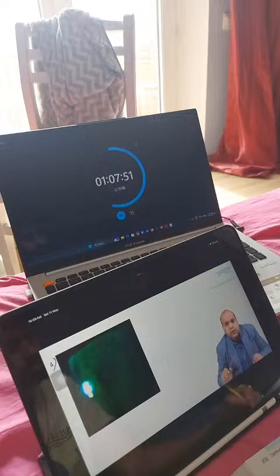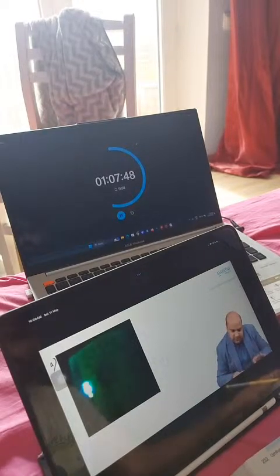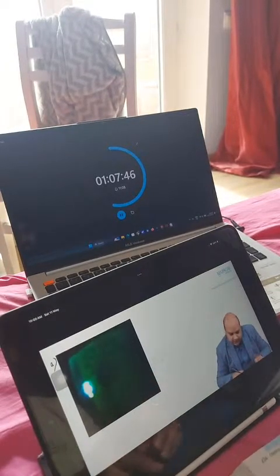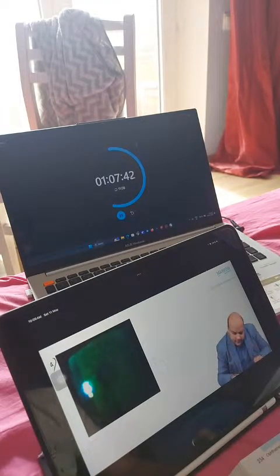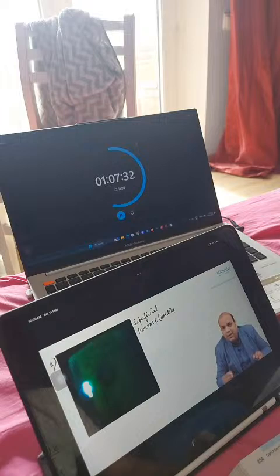A. What do we see in this image? We see number 1, fluorescent staining, that we already know, green colored staining. Throughout the cornea, we get a stippled appearance, a dot-like appearance scattered throughout the cornea. This presentation is known as superficial punctate. As I mentioned previously in other lectures, punctate means dot-like. So that is the word we use for dot-like lesions, punctate. Superficial punctate keratitis. Okay, only SPK.